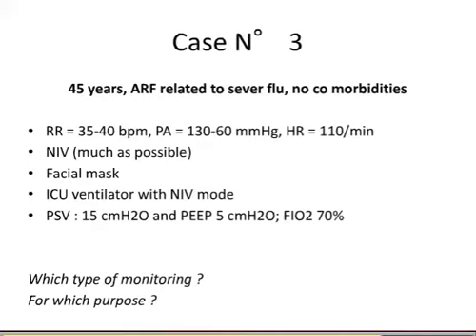Okay, so we have to stop. Just a few words to summarize. For the first patient, we have to focus on the clinical status, but also on tidal volume and respiratory rate, to assess the improvement under mechanical ventilation. For the last patient, the critical point is to decide whether or not to intubate the patient based on the clinical status, arterial blood gases, continuous saturation, and also respiratory parameters, tidal volume. And the other patient is a different case. For each, the clinical assessment is very important, most important.